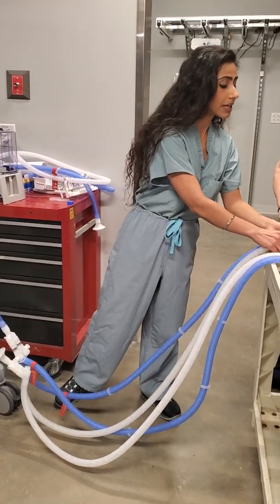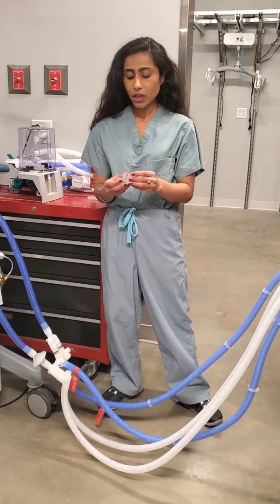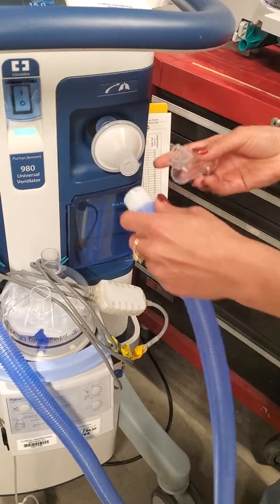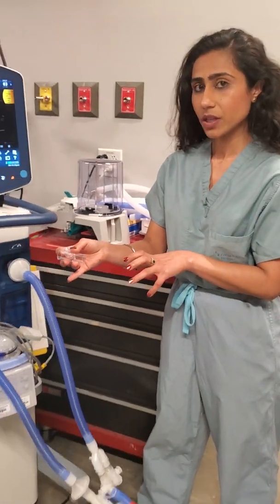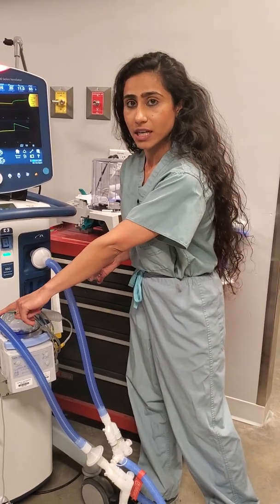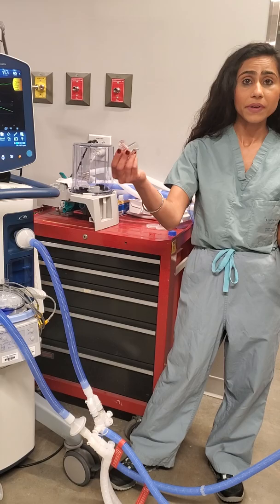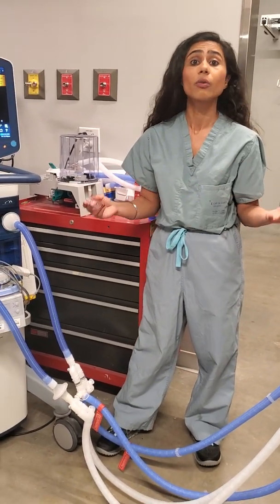Can you connect more than two — say four patients — to the ventilator? The answer is yes. You would need a T piece, which would be connected on the inspiratory side, and each T piece would then connect to its own Y piece, giving you four circuits. Do the same on the expiratory side and you can have four patients on one ventilator. If you don't have a T piece, you can use a Y piece instead. Every institution has different parts and you can get creative with your own.